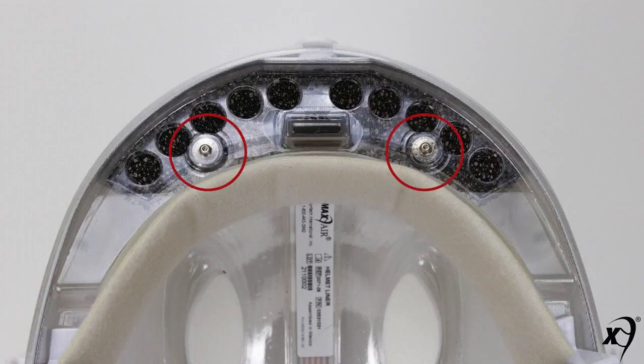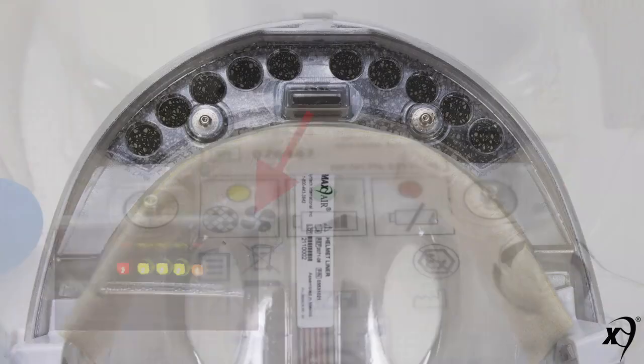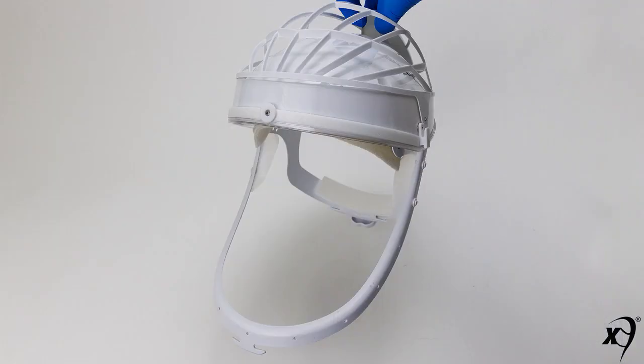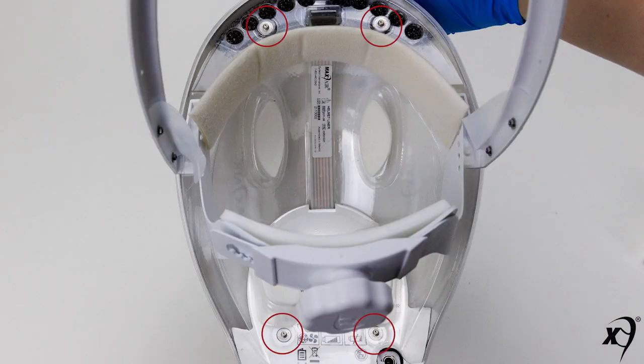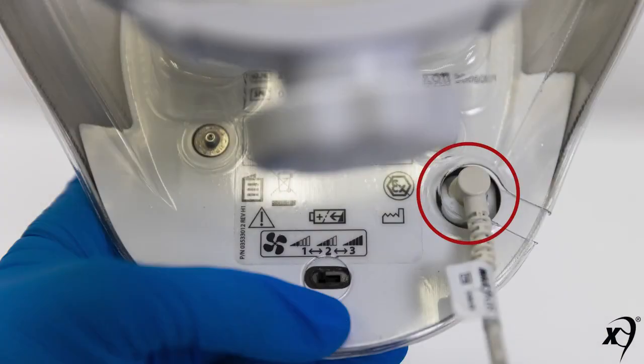Two front underside snaps and two rear underside snaps are provided for the liner, along with a front underside safety LED display. Note that all PR helmets ship with a cage snapped to the side and top rear snaps, a liner attached to the underside four snaps, a chin bar, and a power cord attached to the turn lock connector.